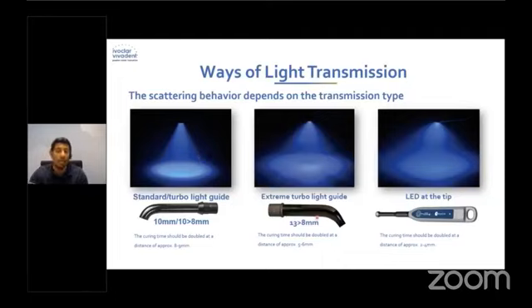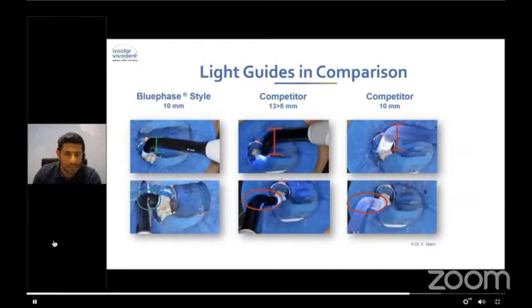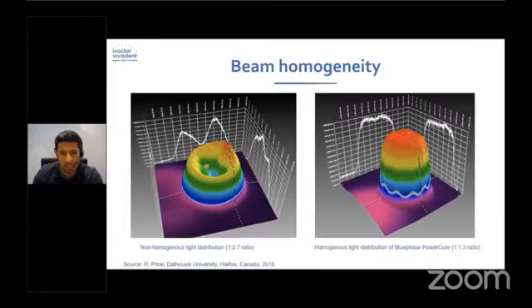This is used if you want to pre-cure quickly for your veneer fits. If you're placing a veneer, you do a turbo light just to fixate it, remove your excess, and then fully cure it. There are light probes that have a glass opening, where some of the intensity is lost during the travel. So it's quite good to have one that's all darkened out, so that it doesn't lose any energy or intensity until it's delivered at the tip of the light probe. Okay, and that's how you get the beam homogeneity.